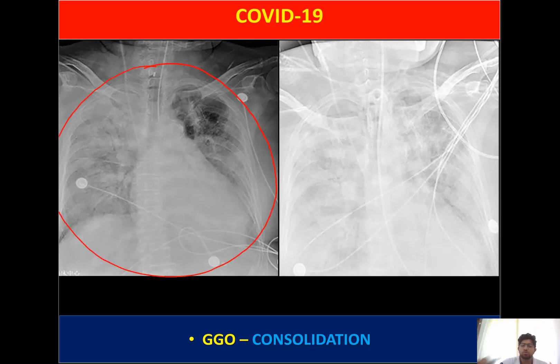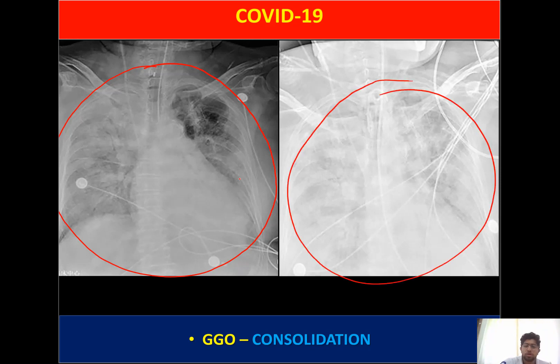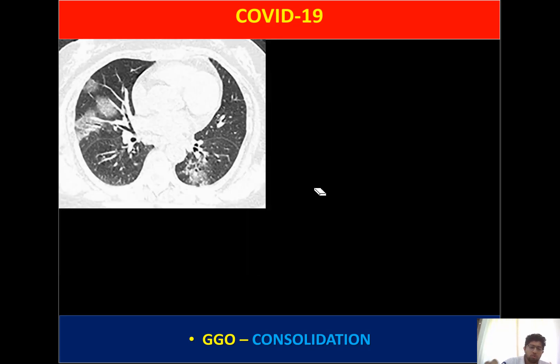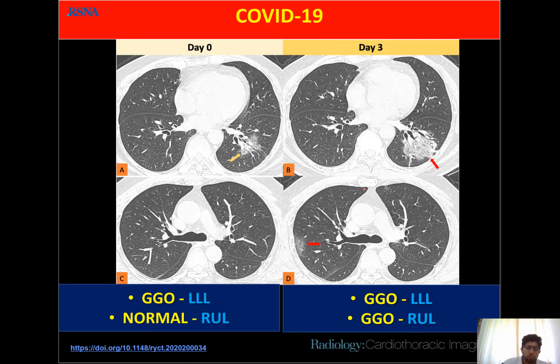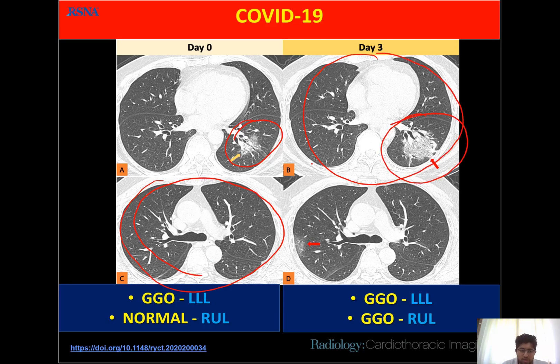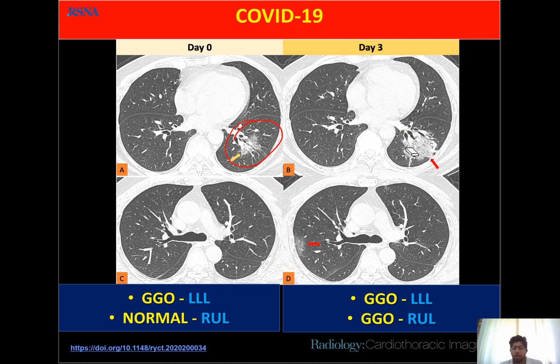This image shows disease progression: diffuse ground glass opacity progressing to diffuse consolidation; the patient could not survive. Another CT image shows bilateral ground glass opacities progressing to consolidation — the same patient again could not survive. On day one, ground glass opacity is seen in the left lower lobe; subsequently it becomes denser, more towards consolidation, with new ground glass opacity forming on the contralateral chest — the disease is progressing and patient may have diffuse involvement.